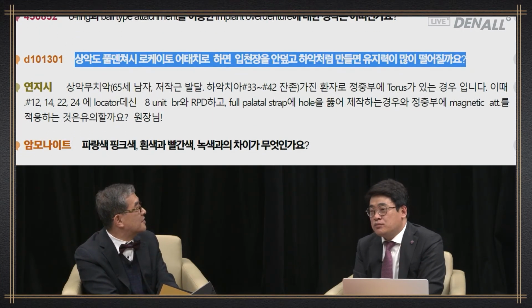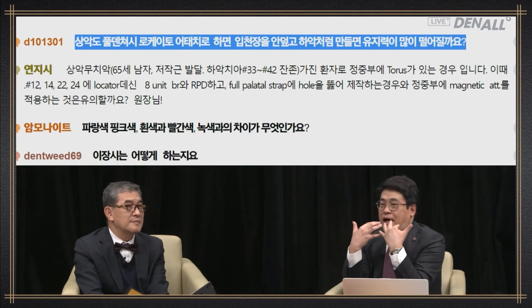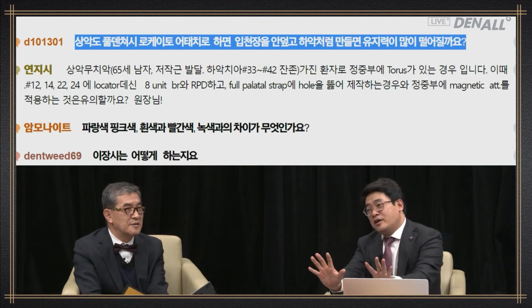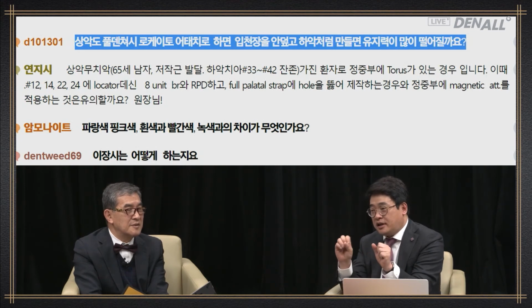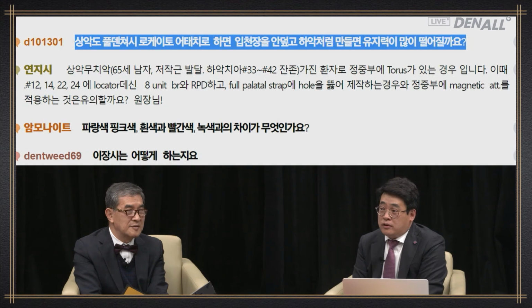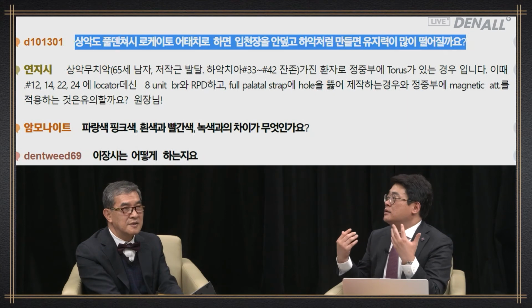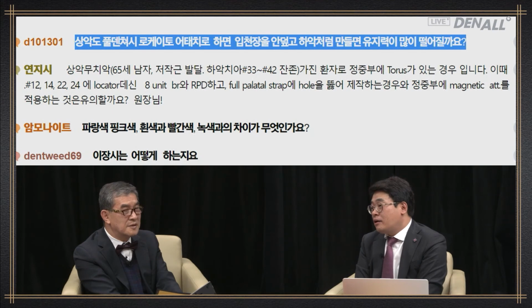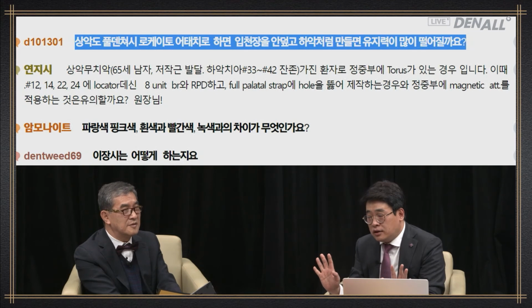When I learned, the bone quality of the upper is weak, and when we place the implant, because of the bone resorption pattern, labioversion occurs. If I place 4 single implants here, and if the occlusal force is 100, the force is not distributed by 25 each and is concentrated to the weakest one, leading to implant failure. Therefore, in the upper, I prefer to use the bar type which connects all 4. That's how I learned. Then, in order to effectively disperse the occlusal force, we need to cover the palate.